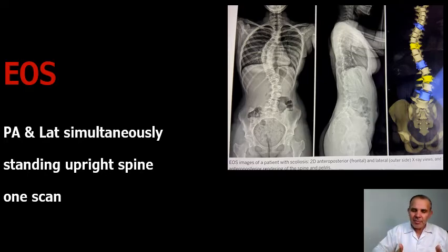That's number one. Number two, the patient is standing in the upright position, so the spinal cord and the vertebral column are aligned, all the weight bearing is effective, and it's in the shot, so we can know the relationship between the vertebral column bone and all the skeletal muscle attachment to it in a weight bearing, gravity, normal position.